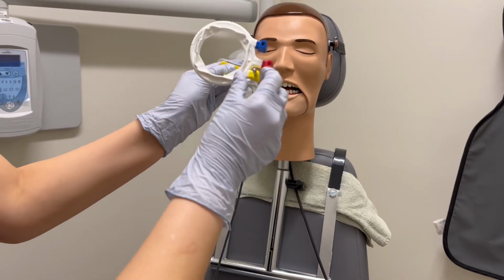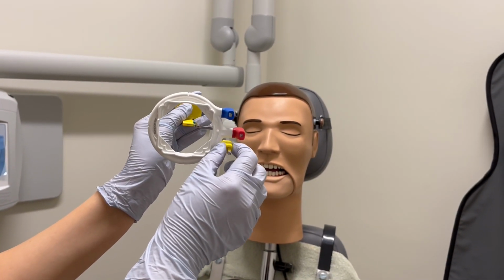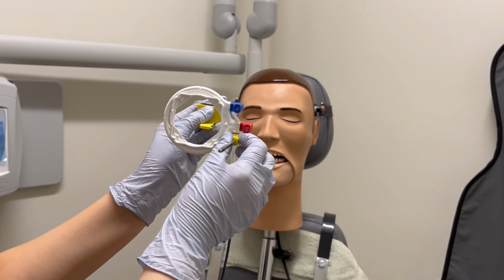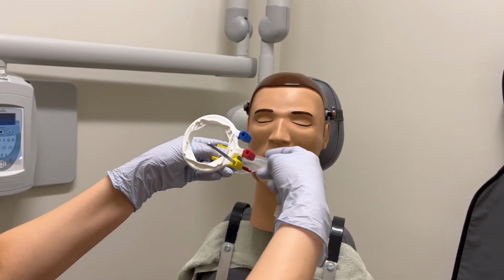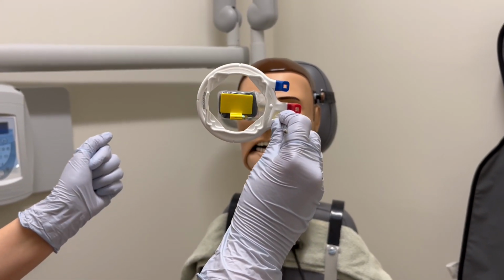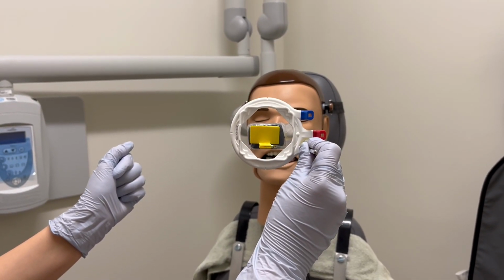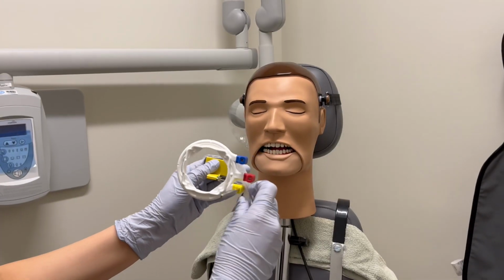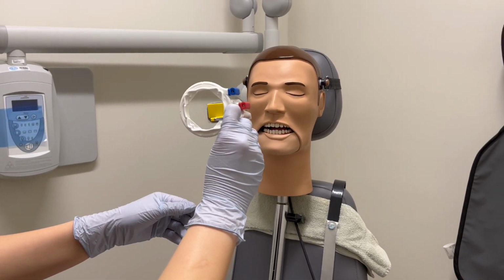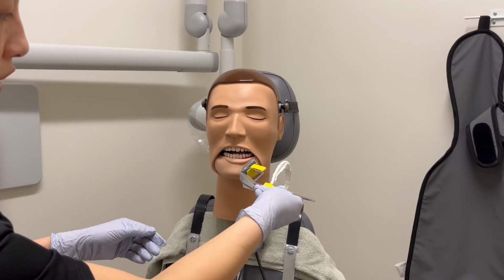Lastly, this yellow section of the plastic ring then attaches to the indicator arm. Final check, is the receptor smack down in the center of the plastic ring? The way that this is assembled for the upper right is going to be the same way for the lower left.